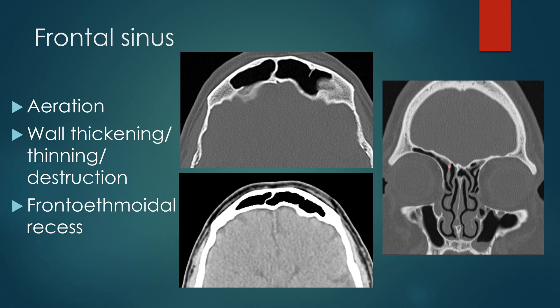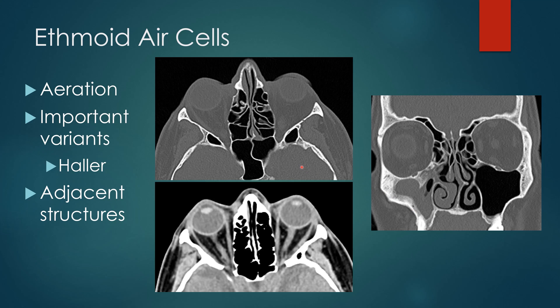Here you can see there's minimal mucosal thickening at the frontoethmoidal recesses. For the ethmoid air cells, you discuss aeration — is there mild mucosal thickening, is it more anterior or posterior, are there multiple opacified ethmoid air cells? Important variants include the Haller air cell, which is an inferoorbital ethmoid air cell. This can result in impaired drainage of the maxillary sinus as it changes the anatomy of the osteomeatal complex, changing its geometry and potentially causing chronic obstruction.